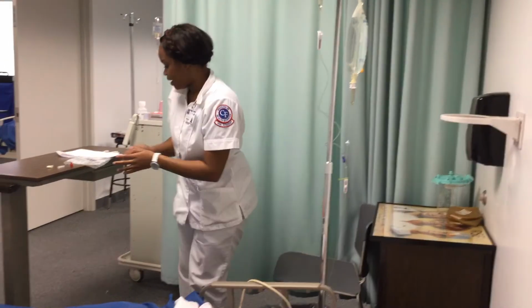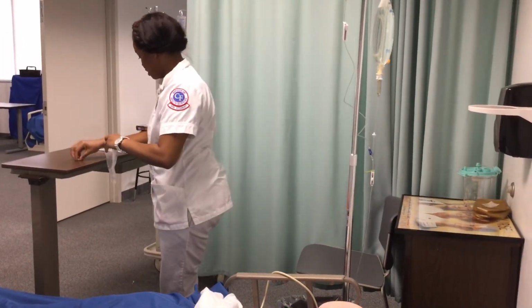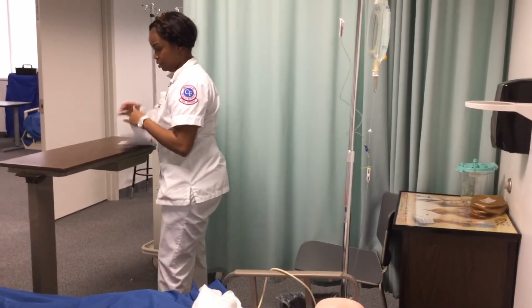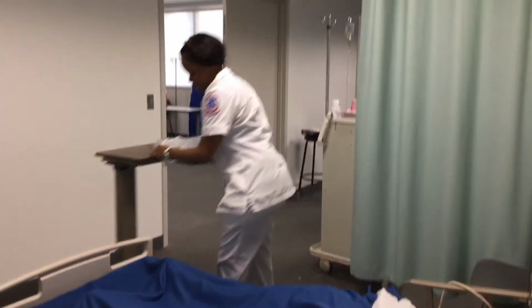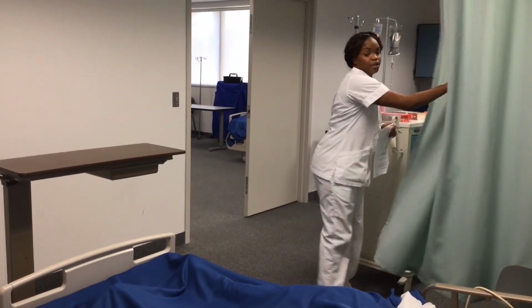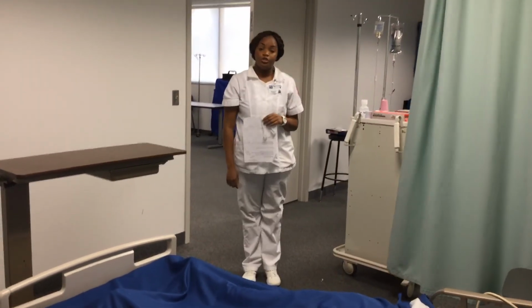Go ahead and clean my hands before I leave. I've gathered all of my supplies. Put the overbed table back. Open up the curtain, and I'll make sure to document.